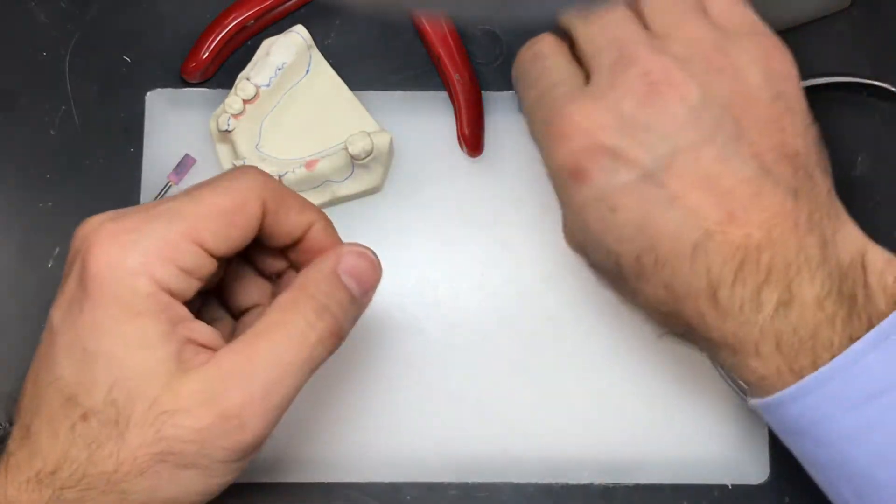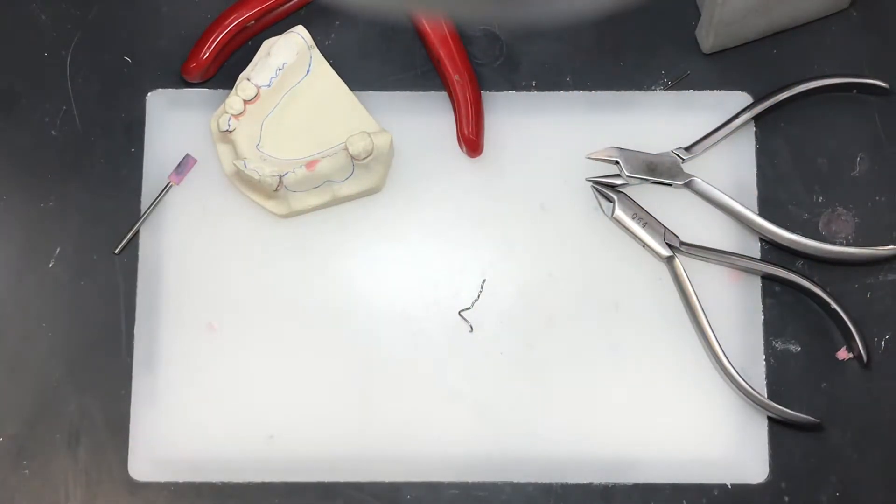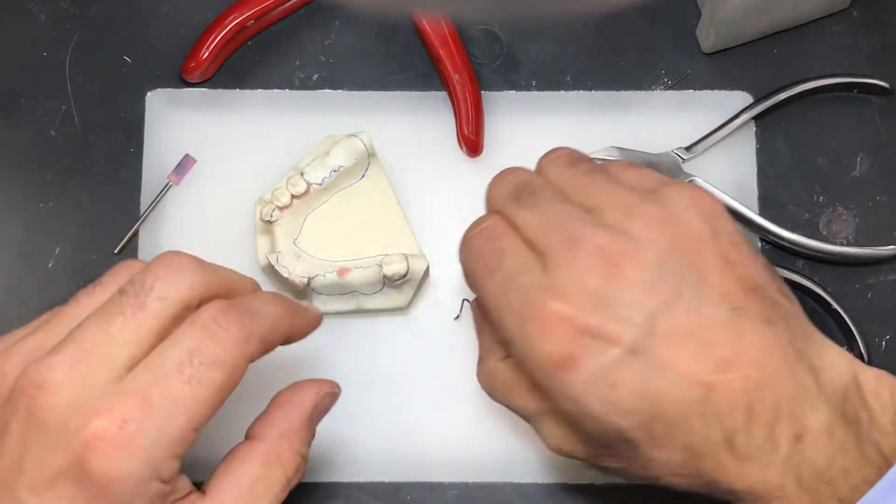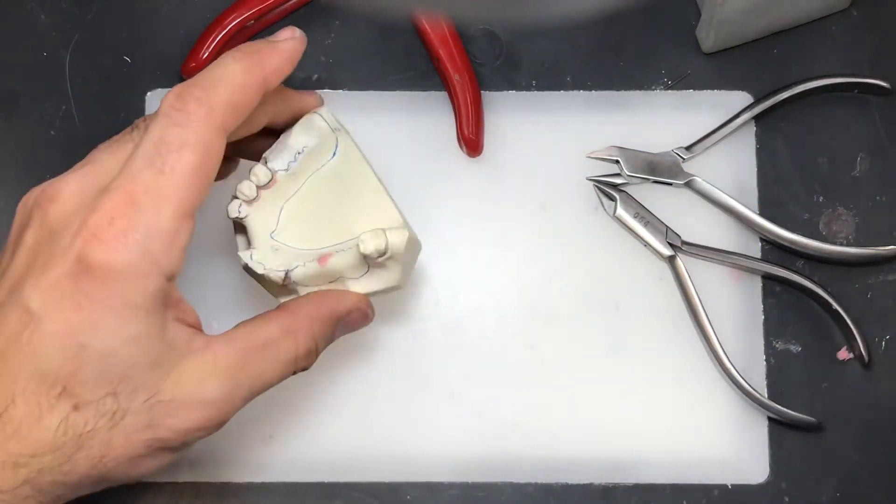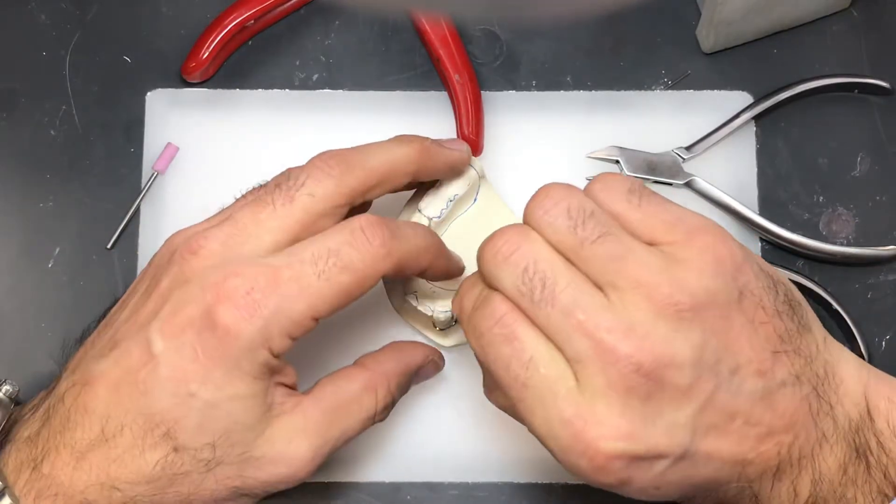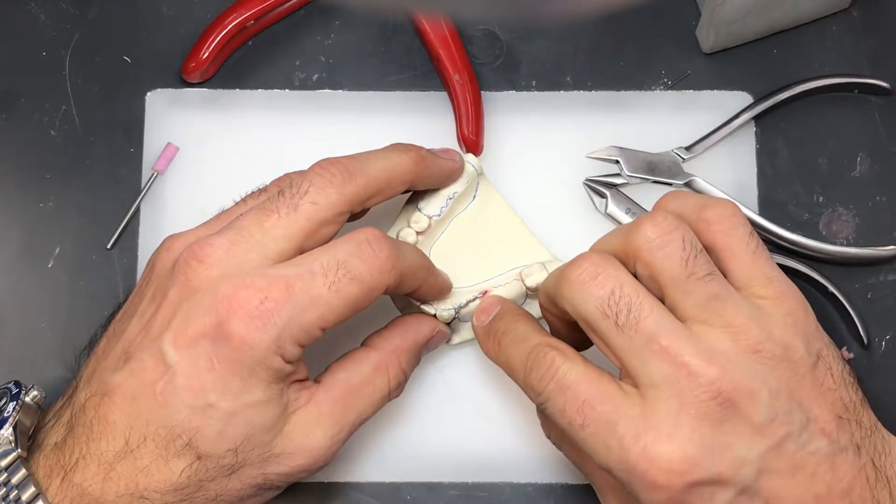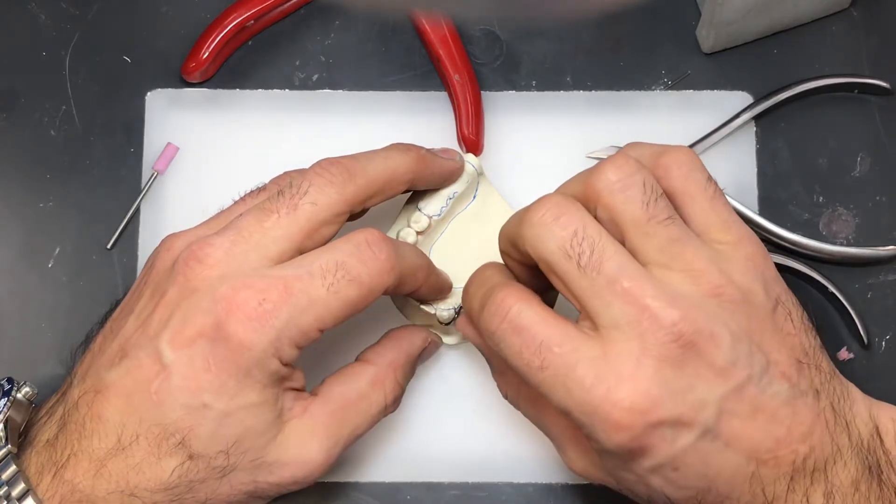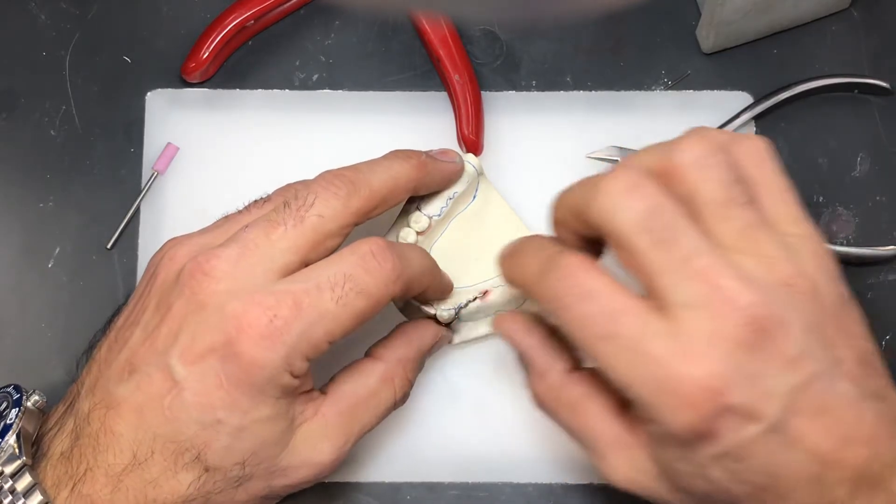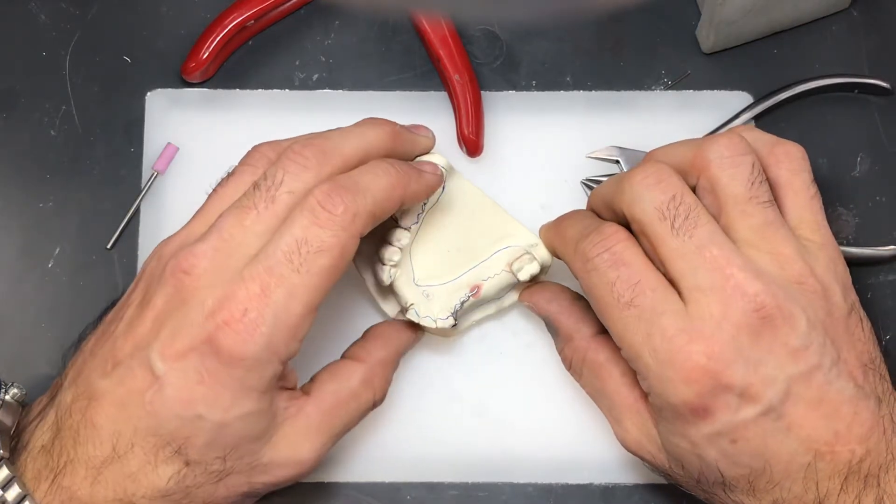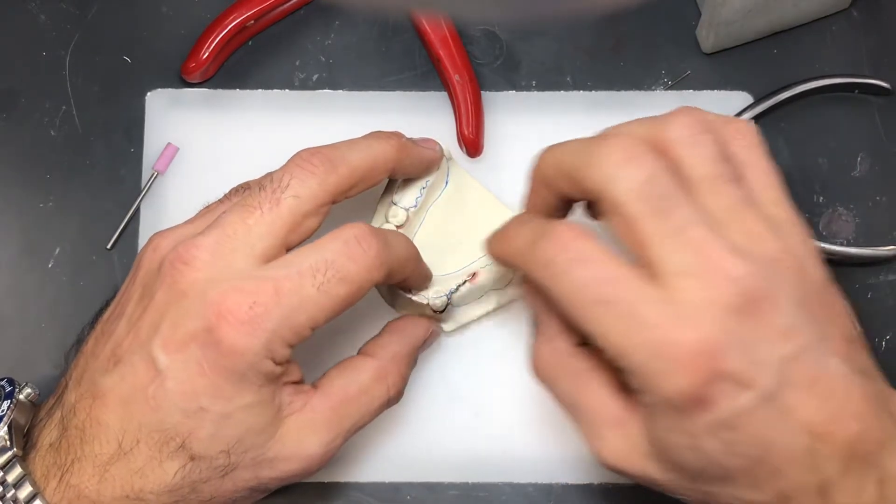Now I'm going to take this wire, place it back onto the cast and see how everything looks again. I'm going to use that little wax to make sure to reposition the wire back to where it was.